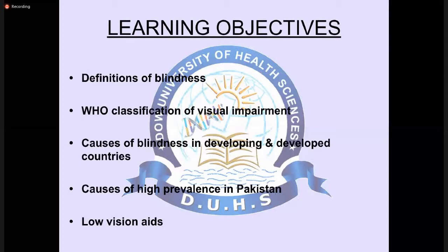with an agreed upon standard. In this notation, the numerator represents the distance between the patient and the eye chart, so normally we take visual acuity on a Snellen chart, and the denominator represents the distance at which a person with normal acuity can read the letters. So visual acuity of 20 by 80 thus indicates that the patient can recognize at 20 feet a symbol that a person with normal acuity can recognize at 80 feet.